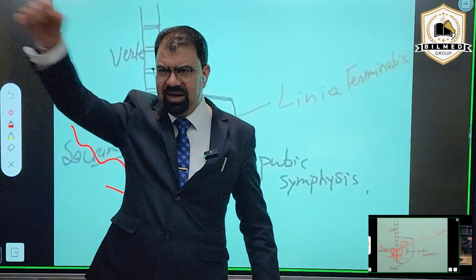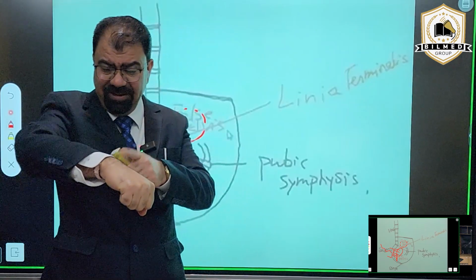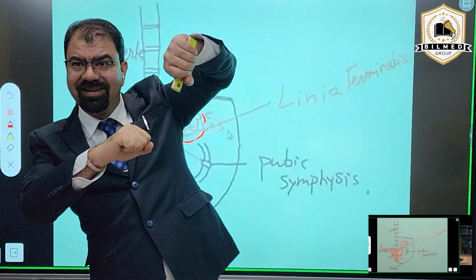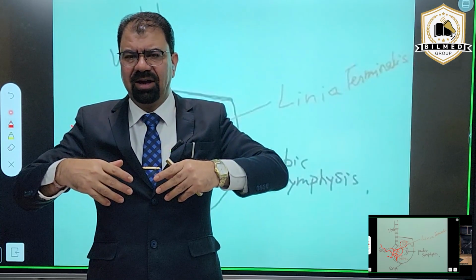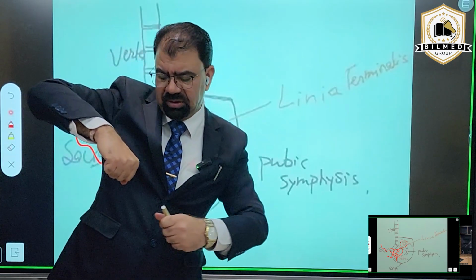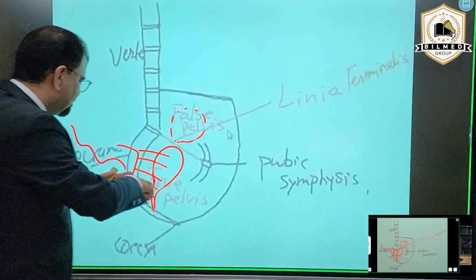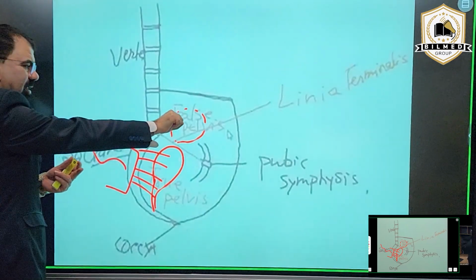Now see, if your probe is like this and your wrist is not moving up, your beam will not get lifted. This is actually called fanning: transverse fanning and longitudinal fanning, sweeping rather. So this wrist tilting up will make the beam hit the false pelvis.